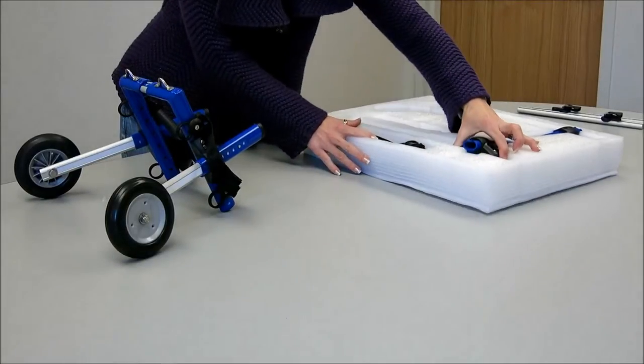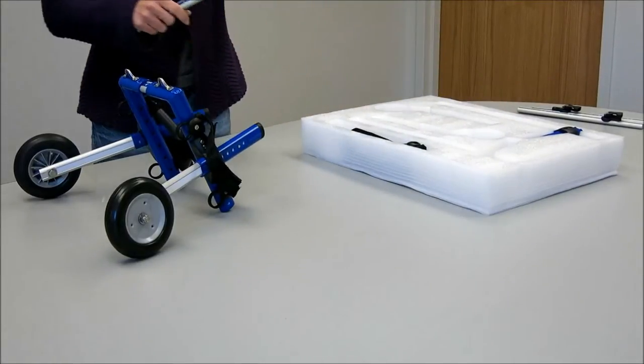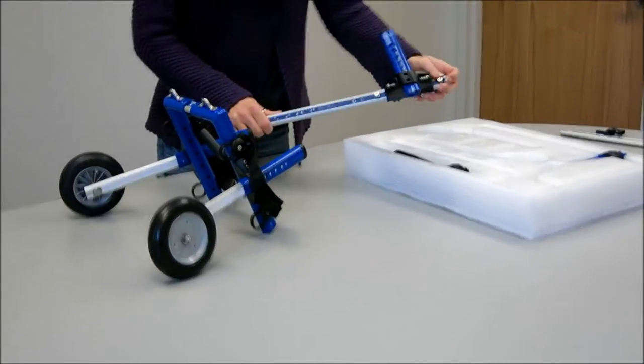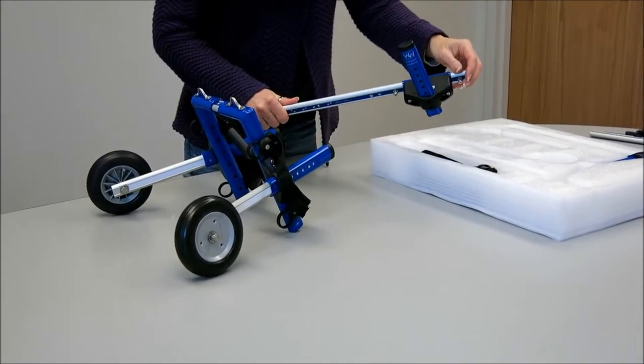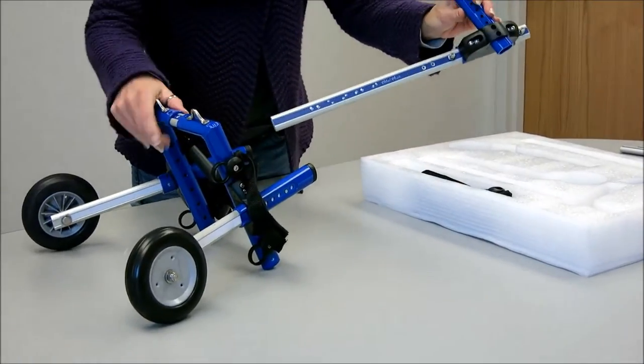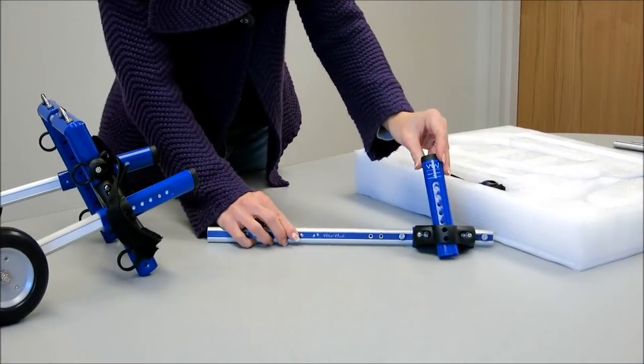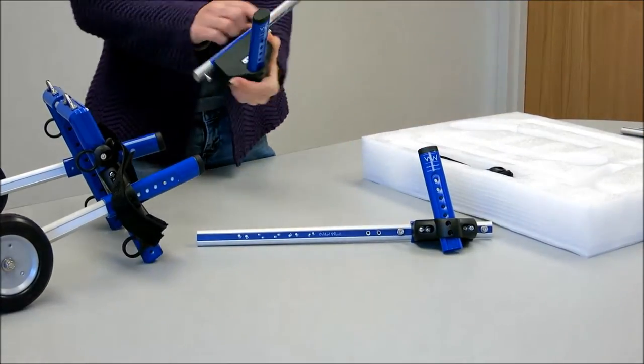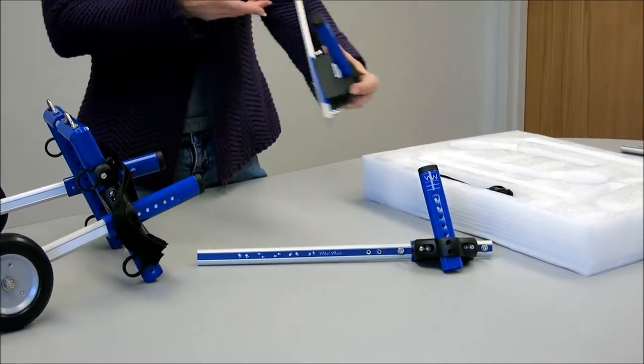Next, we take out the new side extenders. They're labeled left front, right front. Okay, so this one is right, the writing is on the outside. This one is left, labeled, writing on the outside.